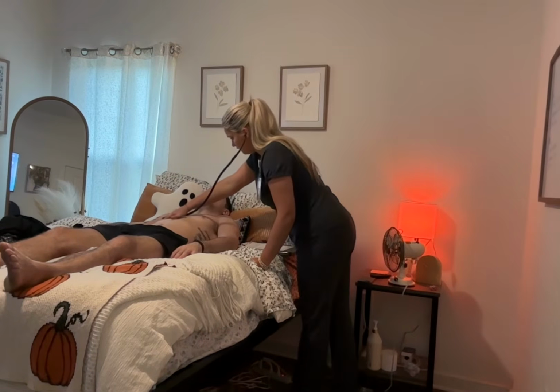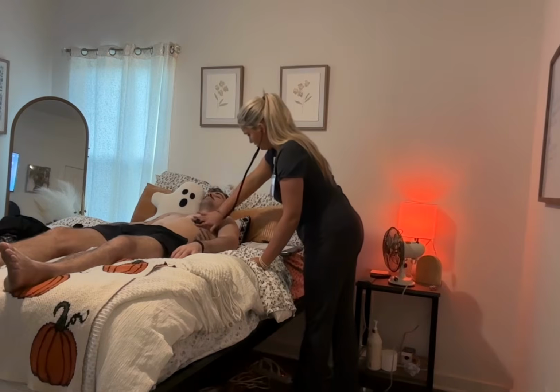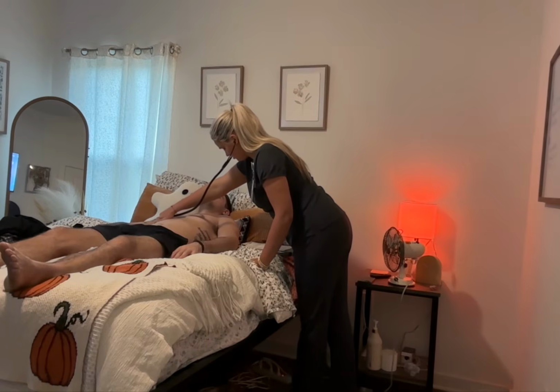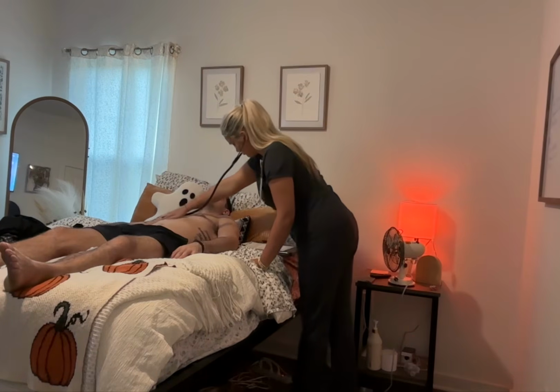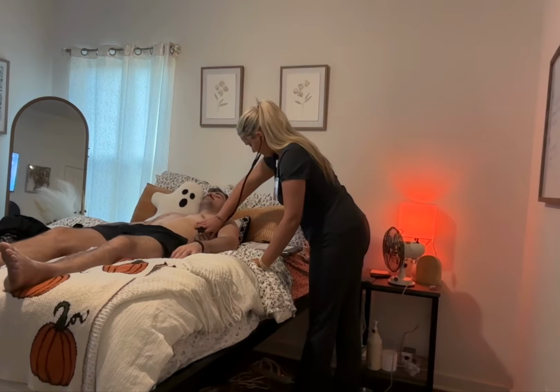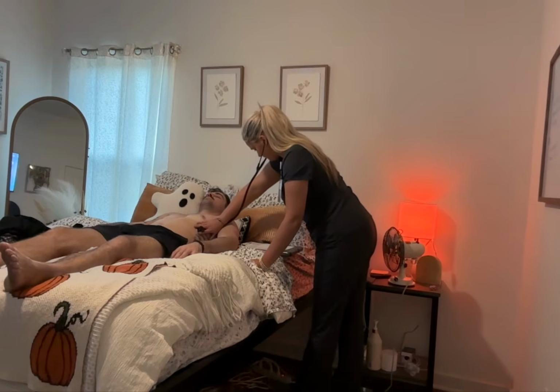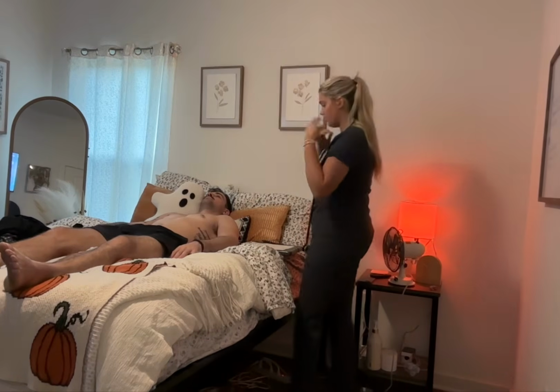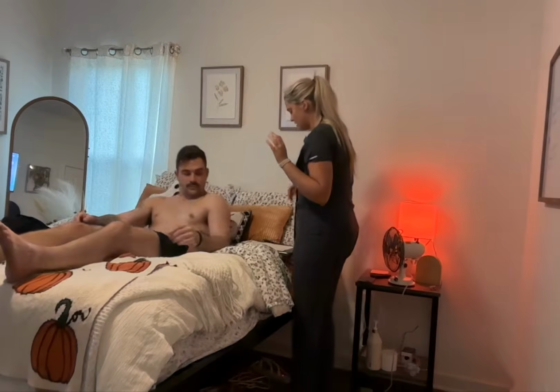And we're going to go around the side of the lungs to make sure we get the full lung base. Again, listening for the full in and out. Alright, so the lungs sound good on the front. So if you can sit up, I'm going to do your posterior side.